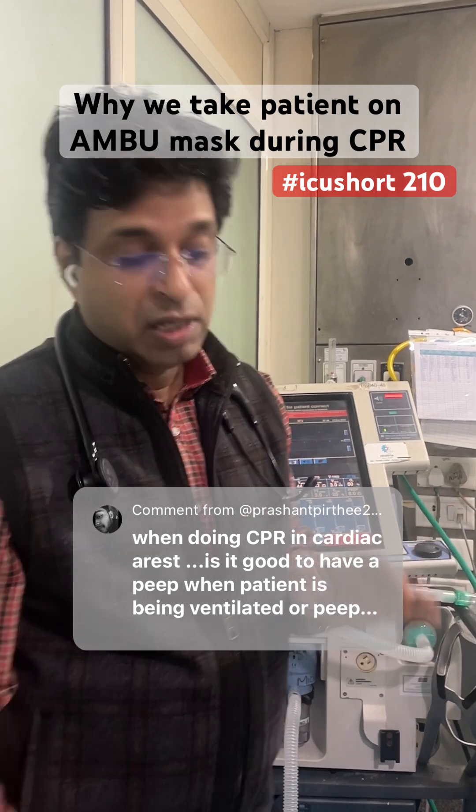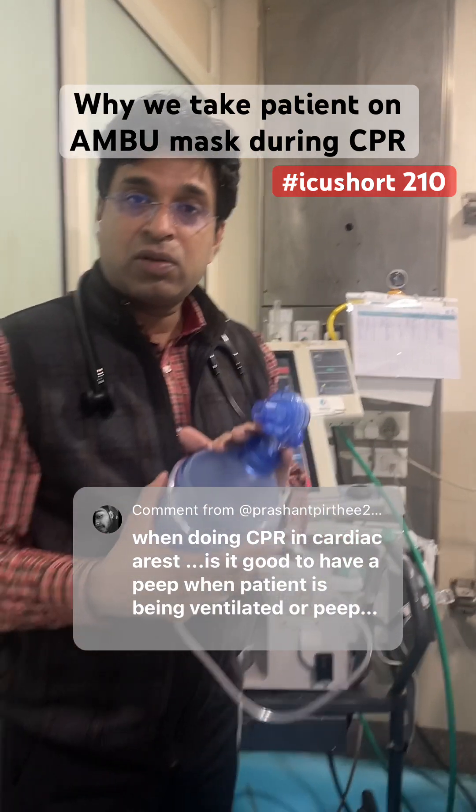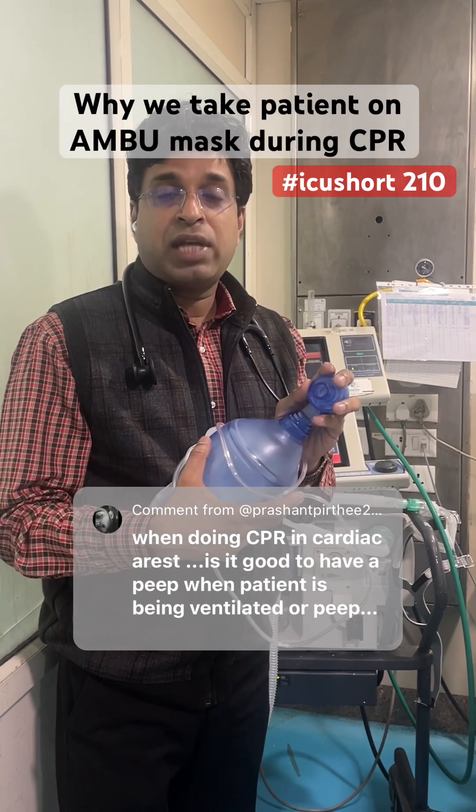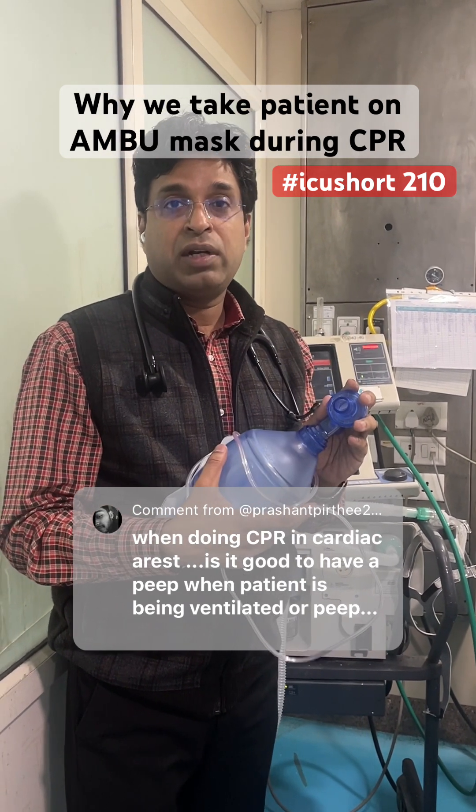The best thing to do is take the patient on the AMBU bag so that we can manually take control of the breath, synchronize the breathing, and properly ventilate the patient.